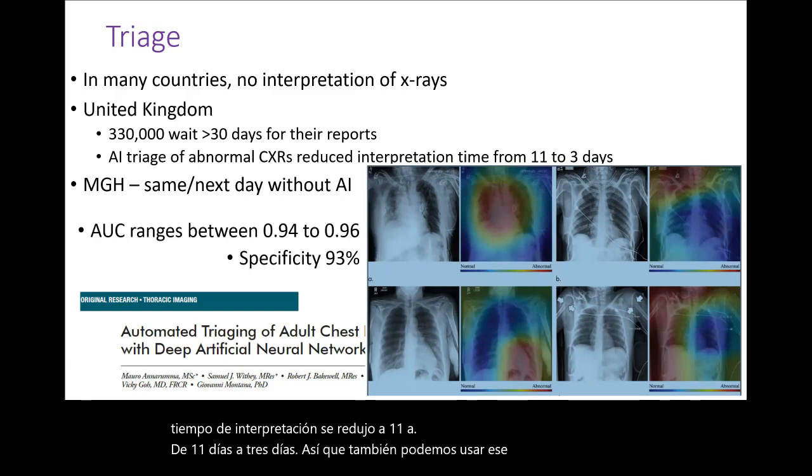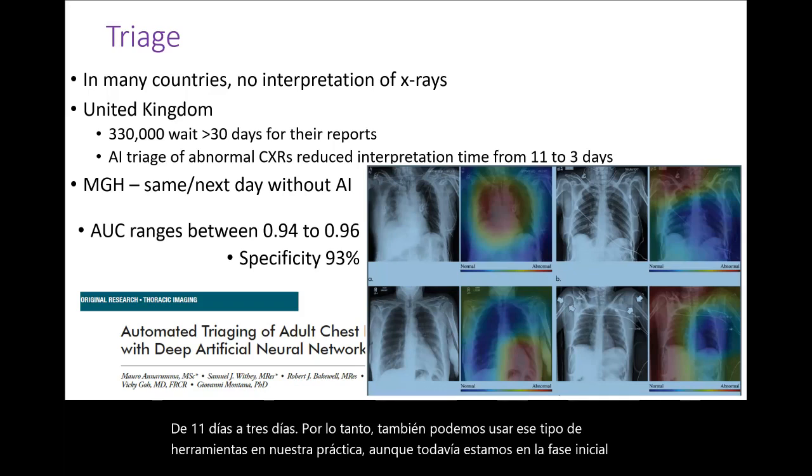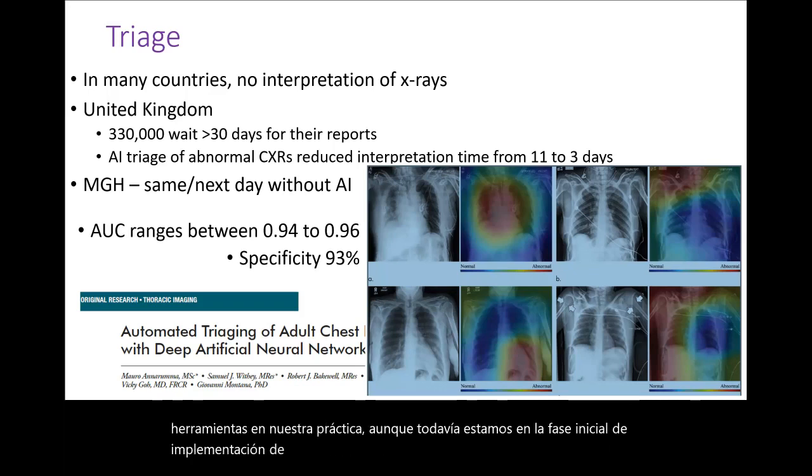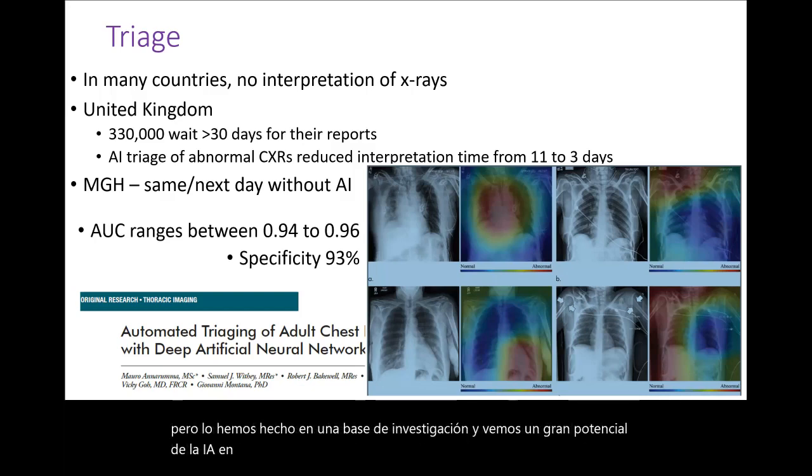We are still in the early phase of implementing these different algorithms in our work practice, but we have done so on a research basis. And we do see a lot of potential of AI in triaging these important findings in various imaging techniques and body parts.